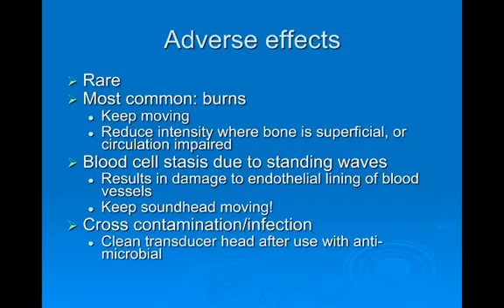Okay, so the other thing that can happen is you can get blood cell stasis because of things called standing waves, and you can damage the endothelial lining, and that can happen very, very quickly. It's just pausing a treatment and talking to someone else, and holding that sound head steady. So the key here again is keep that sound head moving.